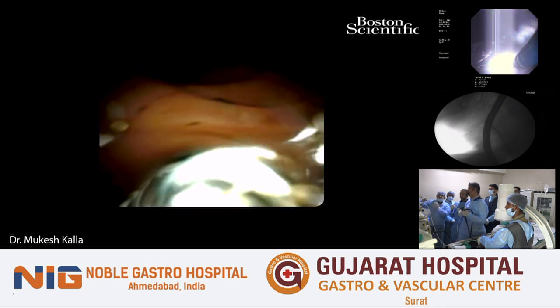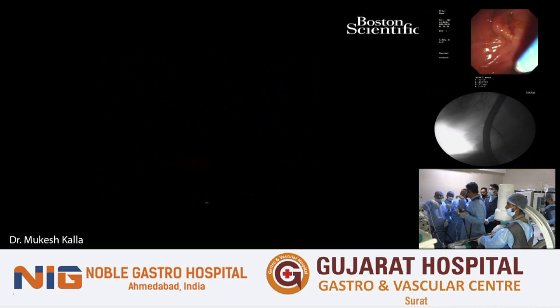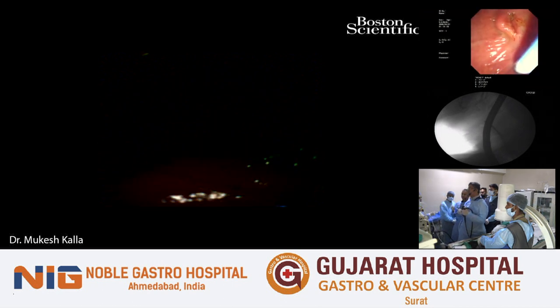Basket nikal. Okay, apna kaam. Ab guide wire dalo. Cystic duct ke andar jayenge. Or we'll see the cystic duct and then we finish the case. Okay.